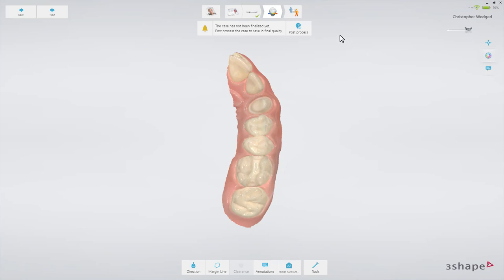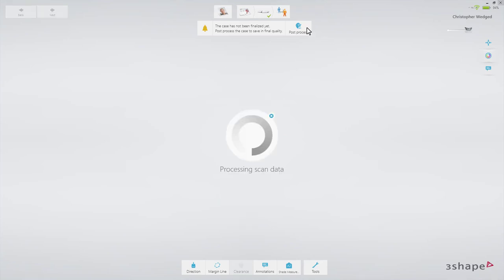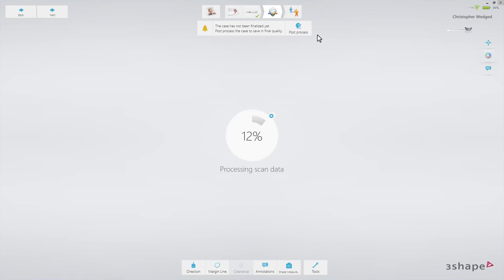Now post-process the scan. Click the post-process button. Please note that when doing post-processing in the analyze step, it will take some time, and you'll have to wait for the process to finish before continuing your work on the case.